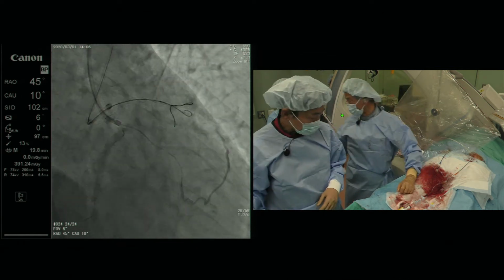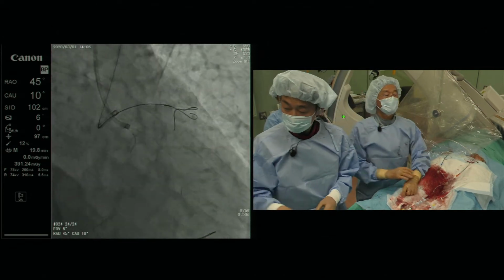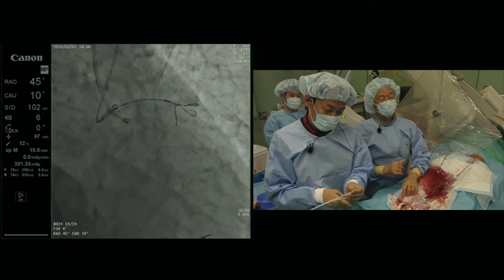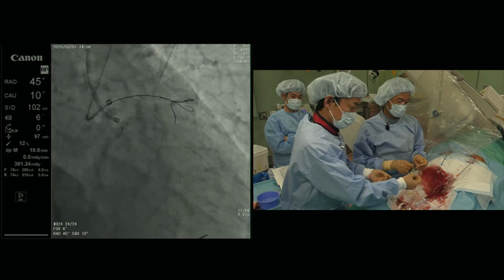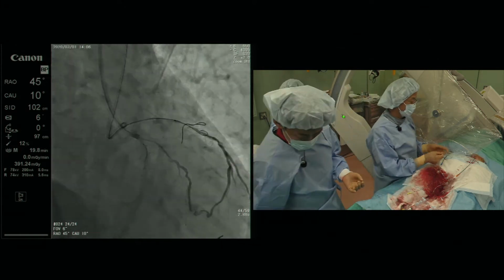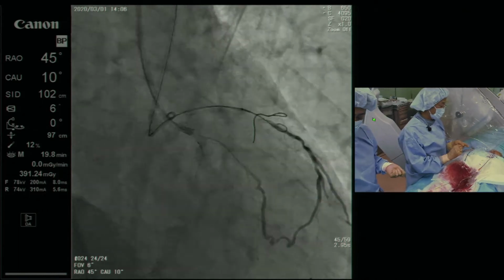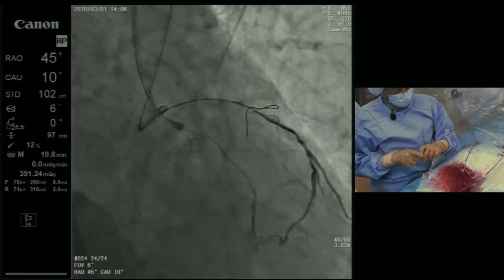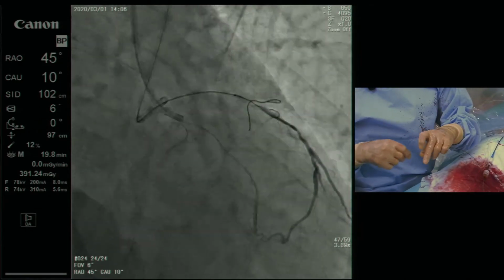Whatever you want to see, inject next to the microcatheter in the artery branch. So your second wire is Gaia Next one? Yes, Gaia Next one. So if the parallel wire technique fails, I will switch to the IVUS guided wiring again.